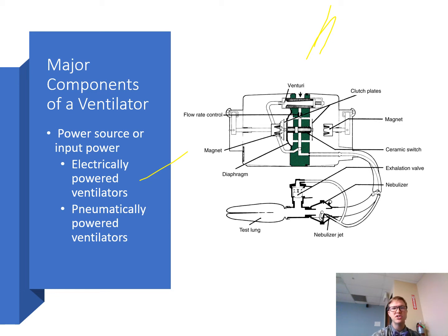Fluidic ventilators usually rely on the principles to control gas flow, like the wall attachment beam deflection, which we'll talk about here. The Coanda effect is the big thing that we talk about there. So an example of a ventilator that used fluidic controls was one called the MVP10, M as in Mike, VP10, a ventilator that just used pure fluidics, right?